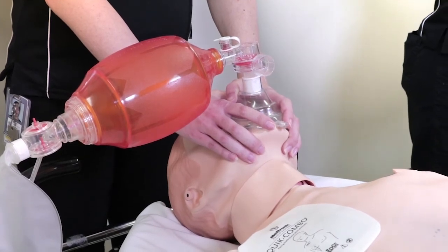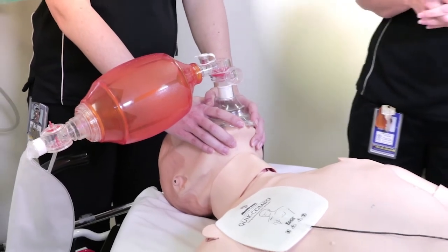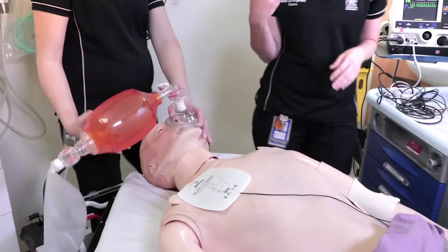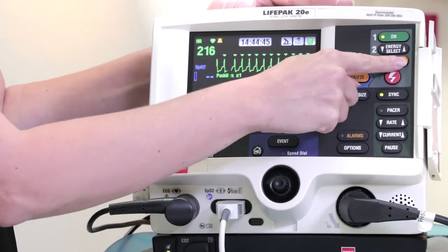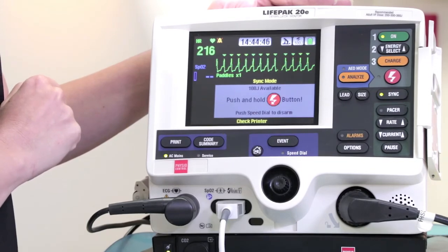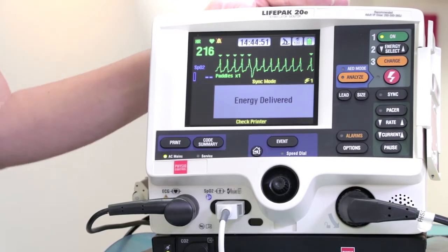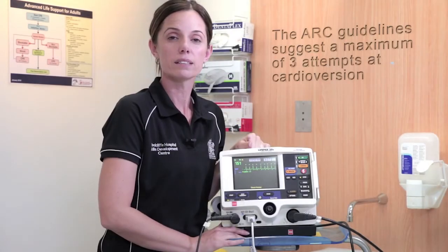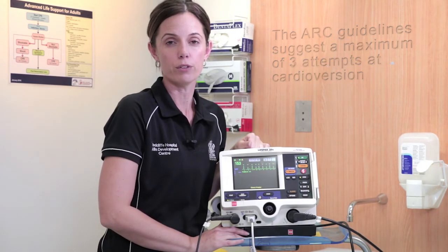Provide sedation and analgesia for the patient and subsequently an airway support person. Once all team members are happy to proceed, ask them to stand clear, charge to 100 joules, and press the shock button. In this case you will have to hold the shock button down for a brief period of time, allowing the defibrillator to deliver the shock on the R wave marker. The ARC guidelines recommend a maximum of three attempts at cardioversion.